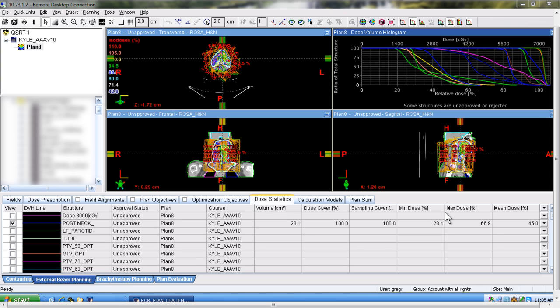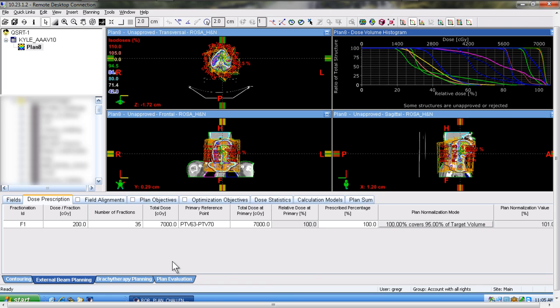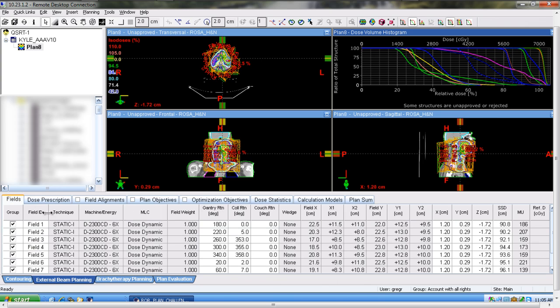The process is fairly simple. When you have the completed plan up in Eclipse before submitting it or exporting it out, it is helpful for the validation process just to have some record of what the normalization value was and the overall monitor unit.